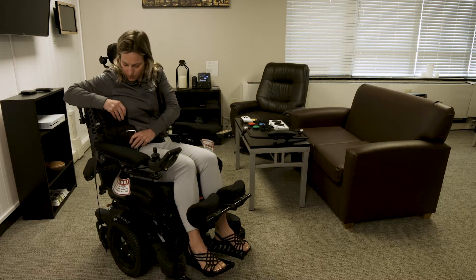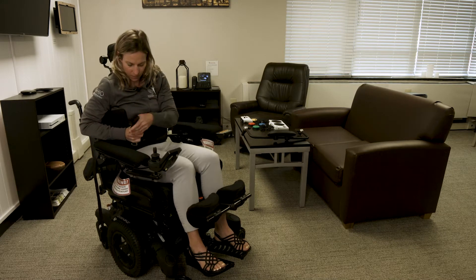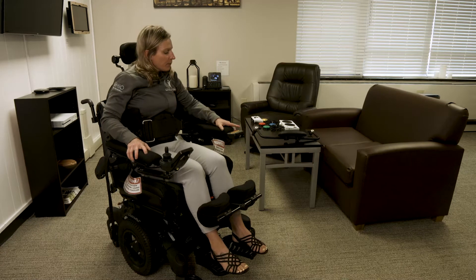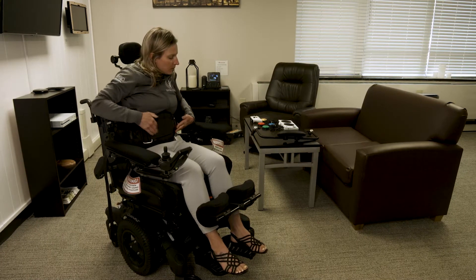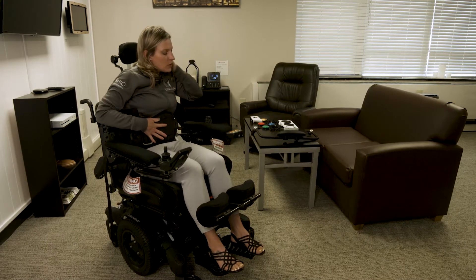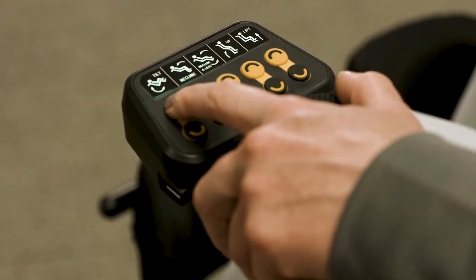In a standing position, you can move throughout your environment if you're reaching into cabinets. You can also elevate the seat without coming to a standing position, which is available in other models — even some wheelchairs that don't have the standing feature — for example, if you want to stock or put things up onto a higher shelf, which is really nice.